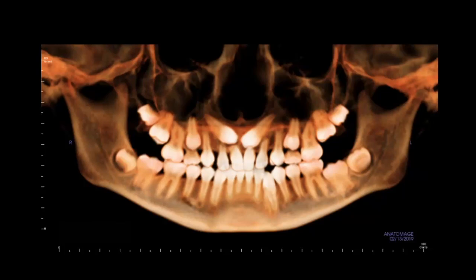All right, so let's talk through this. How does this work? How are we going to treatment plan this? What do we have to do to make this work? Okay, so we've got to get the lateral roots out of the way. We can do that how? With braces, right? Yeah, you can throw some braces on there. You can tip those roots distally. Okay. Any risks in doing that?